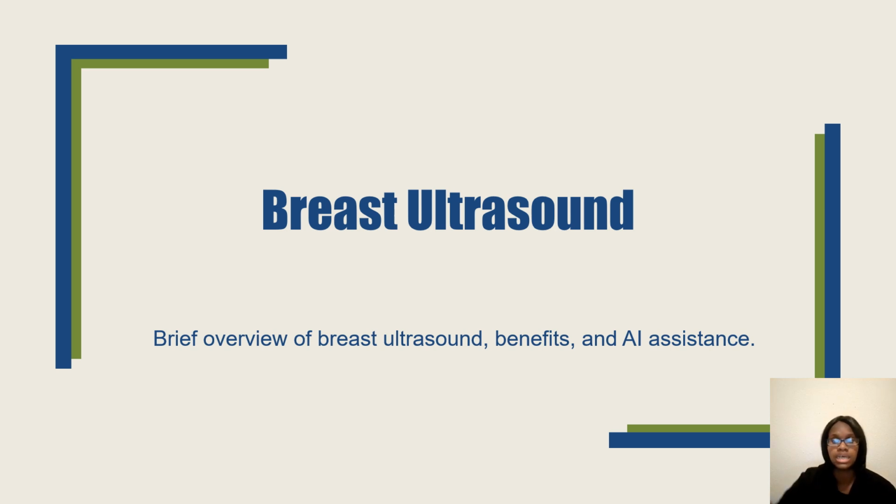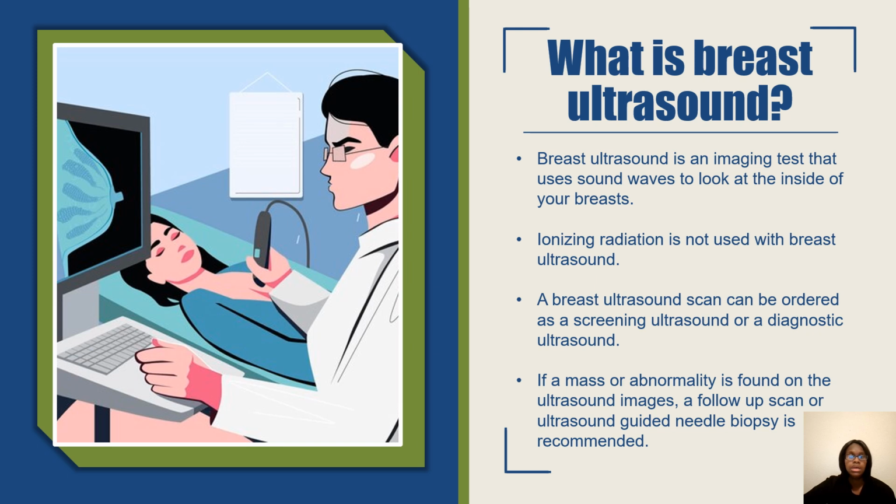Now, breast ultrasound, just a brief overview. So, if you don't know what breast ultrasound is, this is how it is performed. It doesn't use radiation, it only uses sound waves. So, it can be used to image the breast, especially if a patient had an abnormal mammogram or abnormal breast ultrasound. It can be helpful if you're doing a needle biopsy or aspiration of the breast.